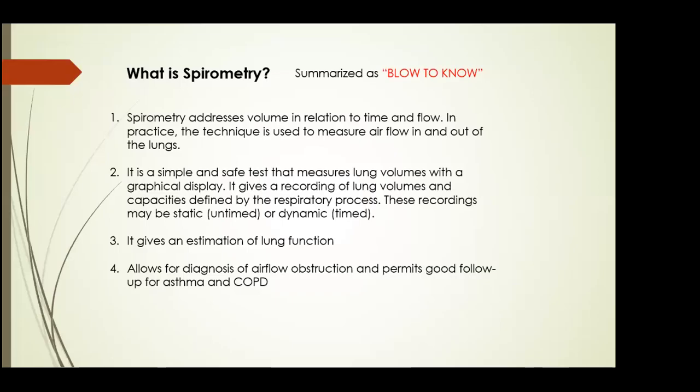in a given period of time. So, and also we are looking at the rate, at the speed at which it moves. Now, it is a technique that is used to measure airflow in and out of the lungs. Now, what I want you to keep in mind, you cannot measure the amount of air in your lungs. You can only measure the one you blow out.